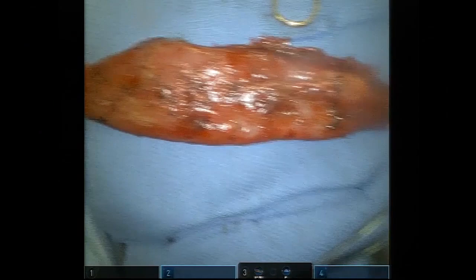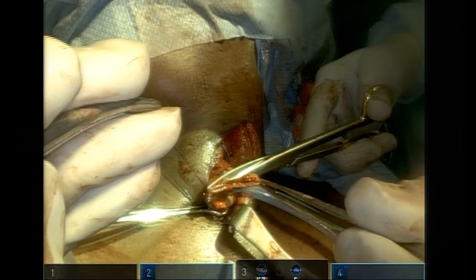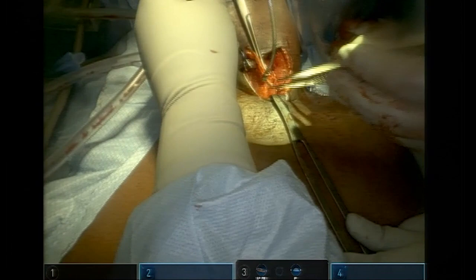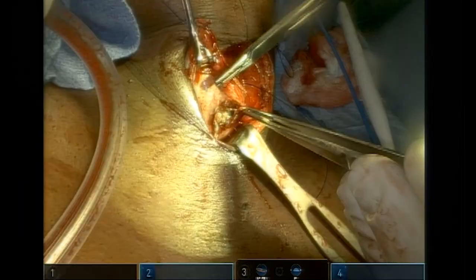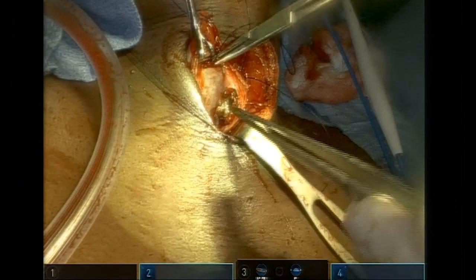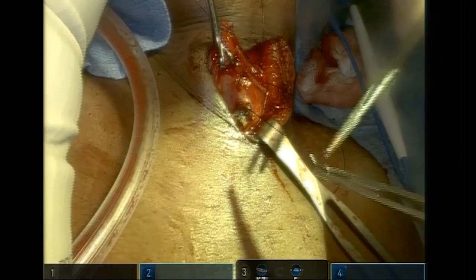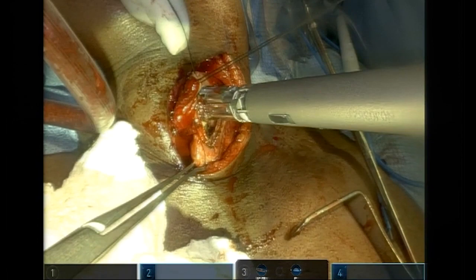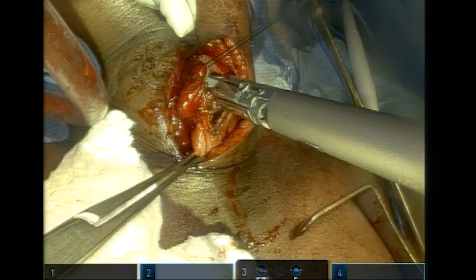Next, the staple line on the proximal esophagus is opened, and a gastrotomy is created on the anterior wall of the gastric conduit. The anastomosis is created by inserting the stapler into each opening. Firing of the stapler creates the posterior wall of the anastomosis.